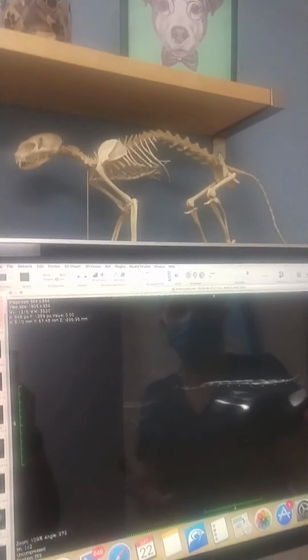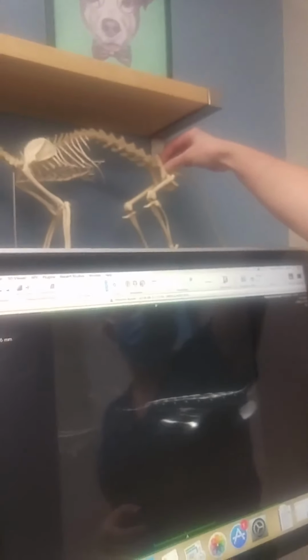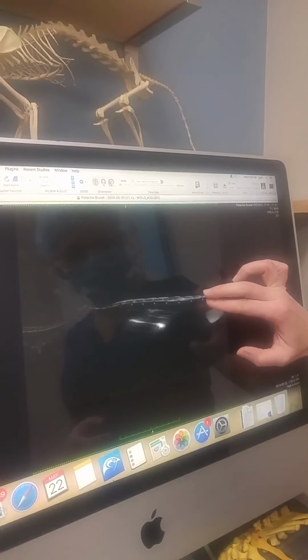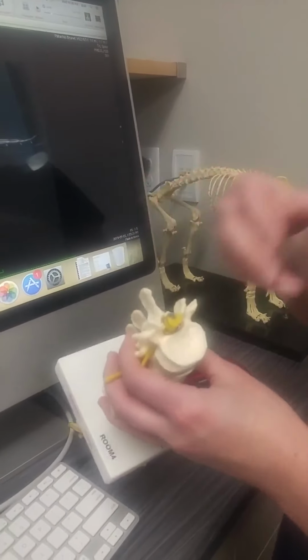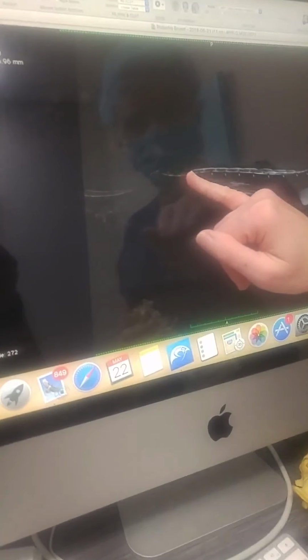And here we have a cat, so that's good. So basically the shoulders are up there, and then the tail is up here. What I'm expecting is a nice band like this that shows my fluid, because we know that there's fluid around the spinal cord, fluid and fat, okay? And what we see here is that there's something going on there.